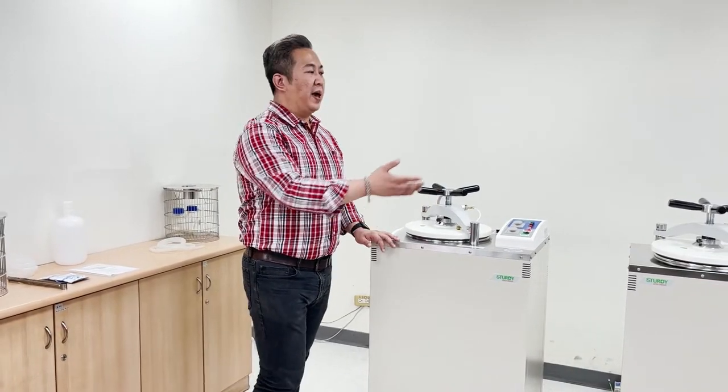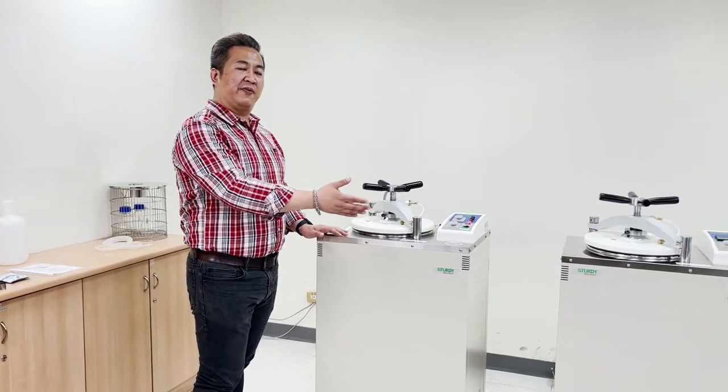Hi everyone, welcome to today's product introduction from Sturdy Industrial. My name is Andy, representing Sturdy Industrial, a member of Weill Incorporation. Today we will be introducing the vertical autoclave from Sturdy. The two models we have here today are the SA300V-IF and the SA300V-L, which I will demonstrate individually.